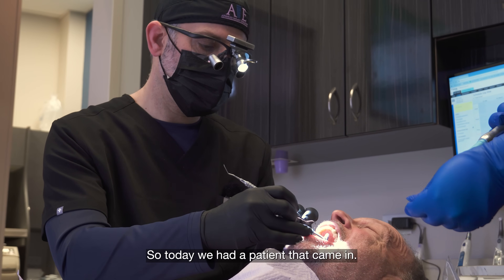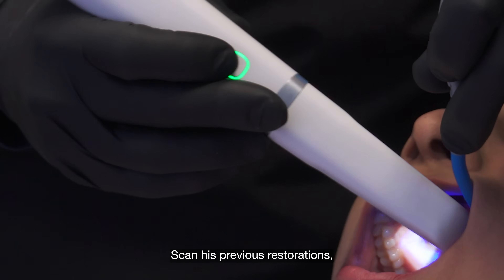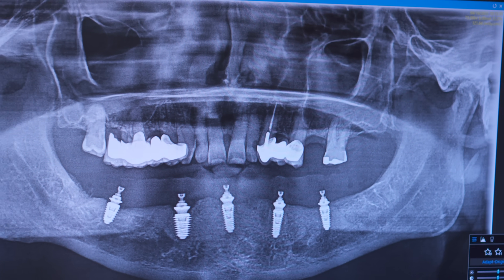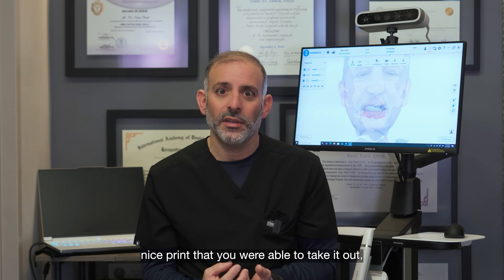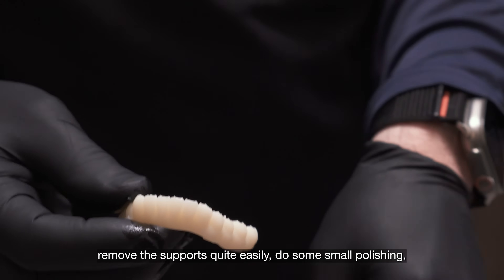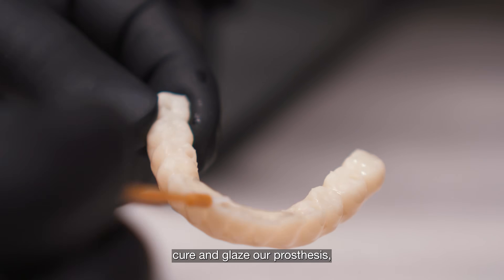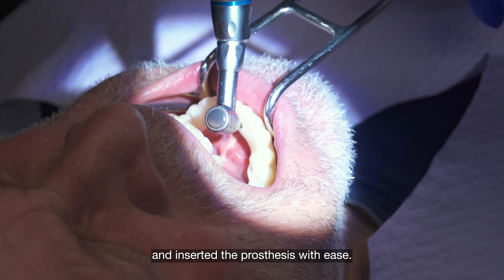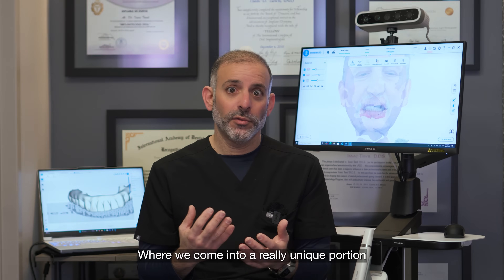Today we had a patient come in. We used our Elite Wireless to scan the patient and his previous restorations, and we made some changes to his temporaries. The beauty of the DLP is it's such a clean, nice print — we were able to take it out, remove the supports quite easily, do some small polishing, cure and glaze the prosthesis, and simply insert it into the mouth with ease.